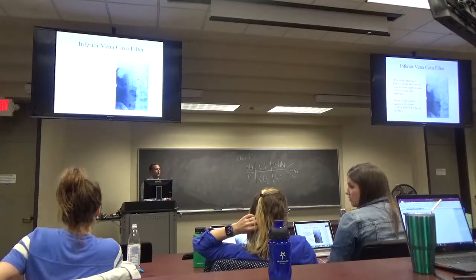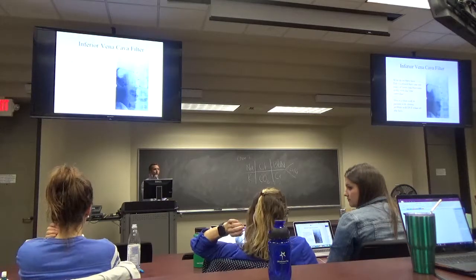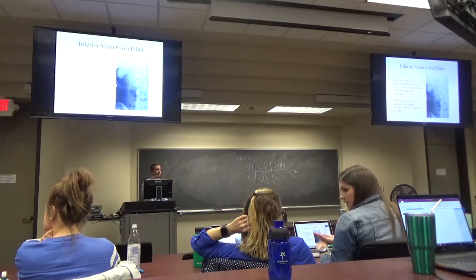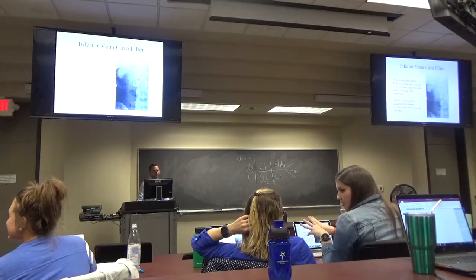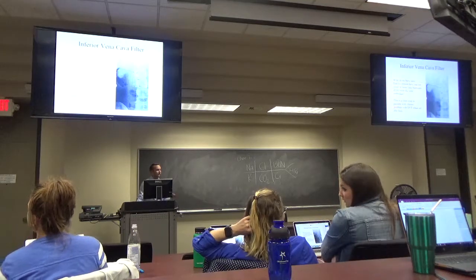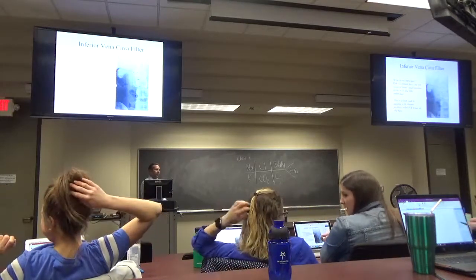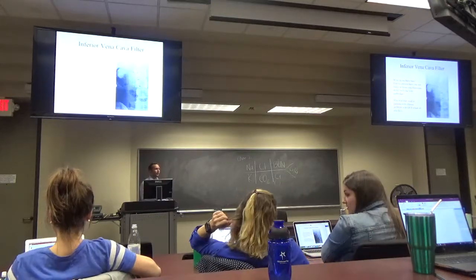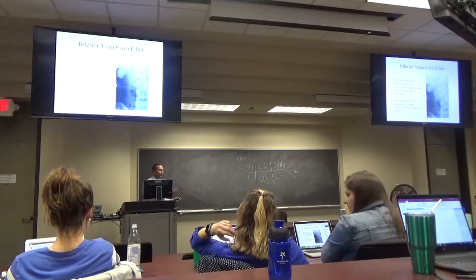Doppler just uses, have you ever heard of the Doppler phenomenon, like when a train comes at you, it's way louder than when a train's going away from you, but it's the same distance. It uses that same phenomenon with blood vessels. Is that what shows the red and blue? Yeah, it shows red and blue. Going toward and away. Exactly, so whichever way you're facing the probe, you could do blue or red, and so you're basically just showing whether you have regurgitation or.